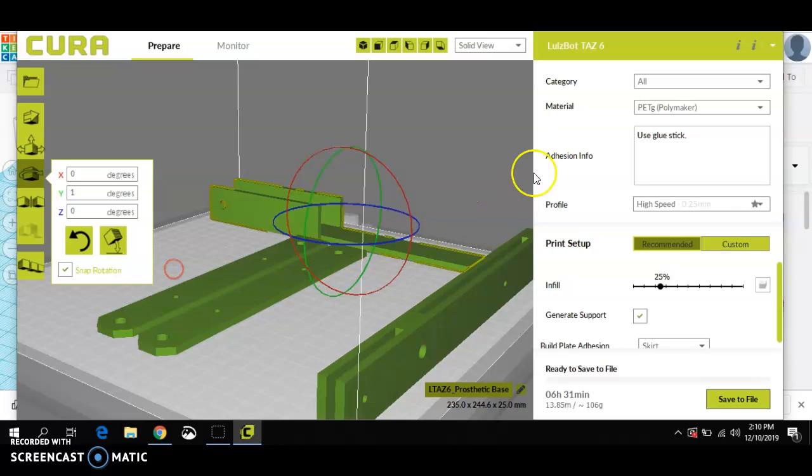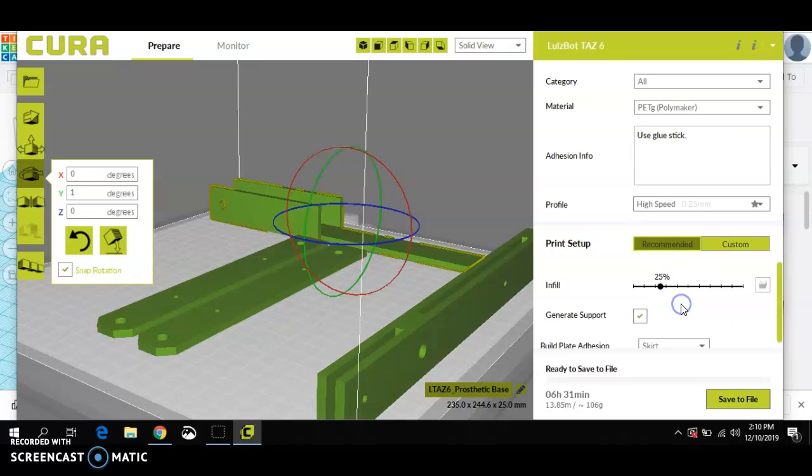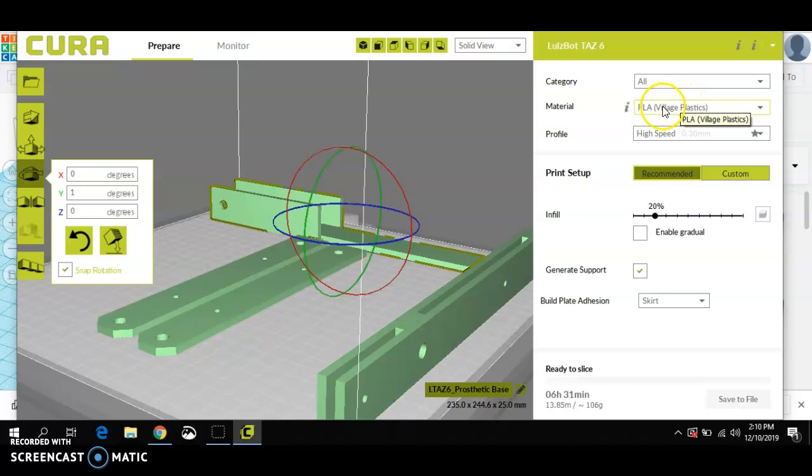So before printing, we need to go ahead and change the material. The material settings determine things like the print temperature, which is super critical. Printing too hot will cause warping and things won't stick to the print bed. So different plastic materials require different settings. And we always use PLA with the Hatchbox PLA that we have. It's not the same brand of PLA, but the settings work as well.